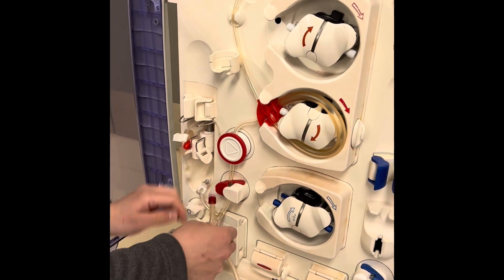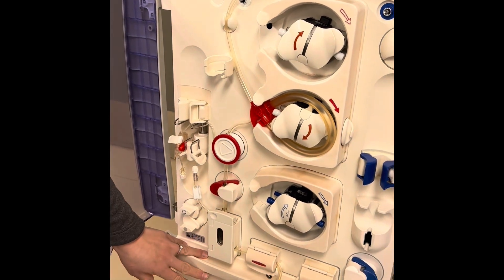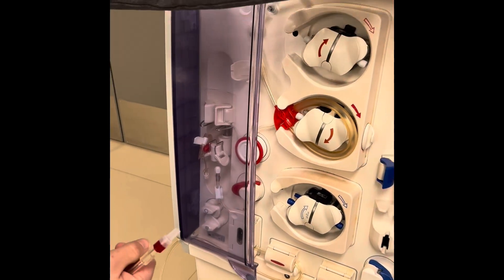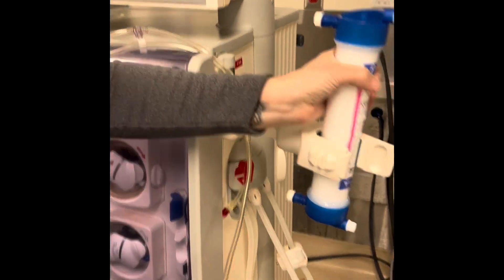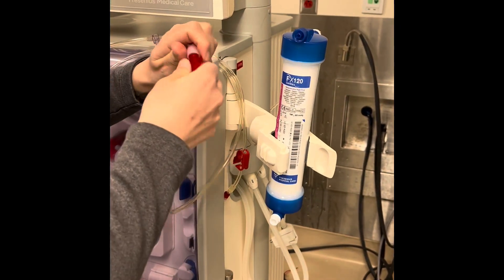Now I'm going to put in my arterial clamp, my blood volume monitoring door, my blood temperature monitoring, and I'm going to put my tubing on the side where my patient would be. I'm just going to attach my arterial tubing to my dialyzer.